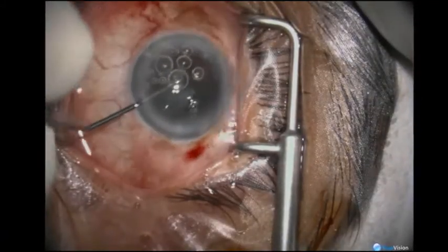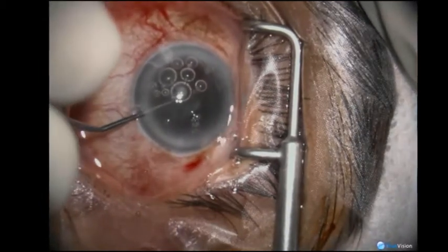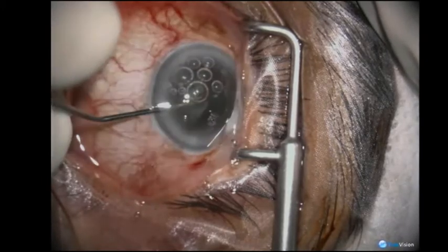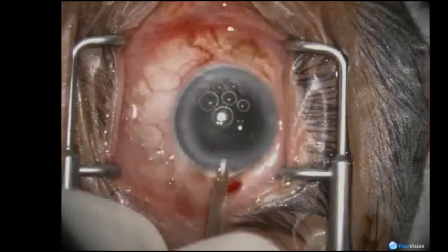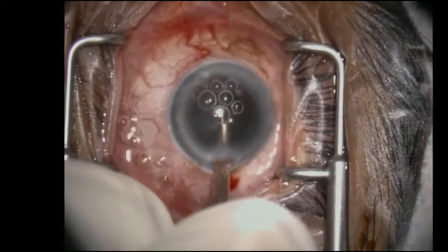The next issue was moving the IOL into the bag. Luckily, the pupil dilated sufficiently. The IA was used to aspirate the cortex.